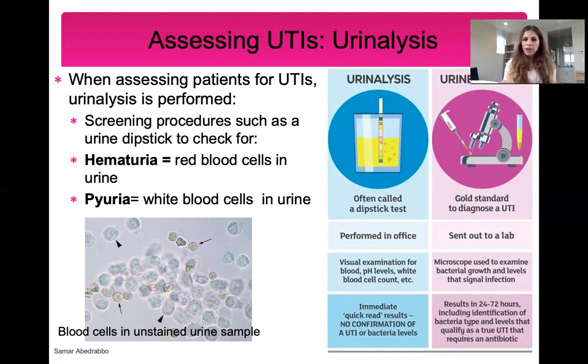You can look at blood in the urine. Blood in the urine is not a good thing because it indicates inflammation.